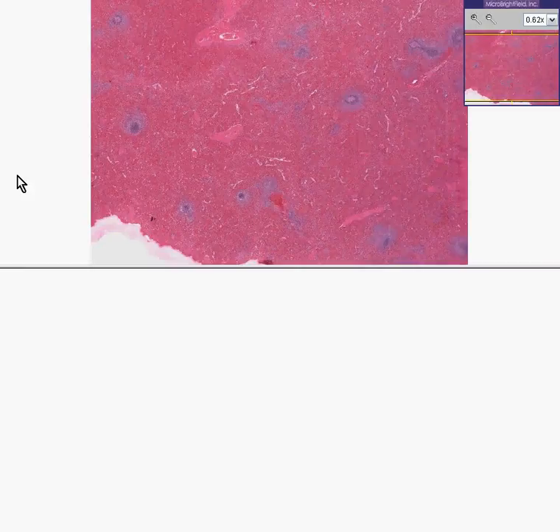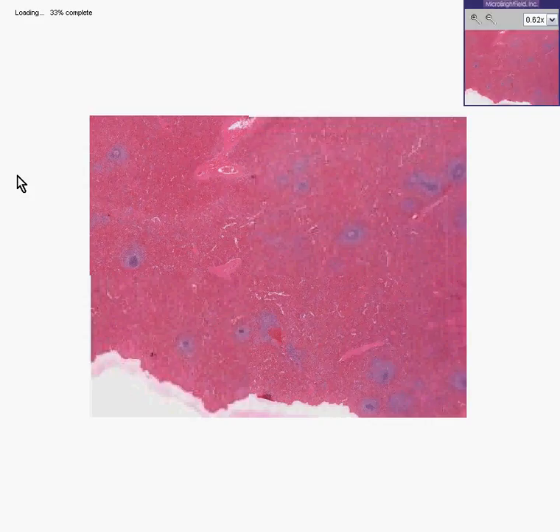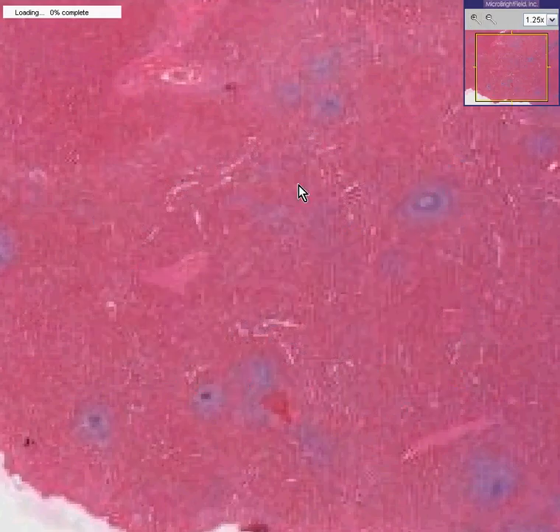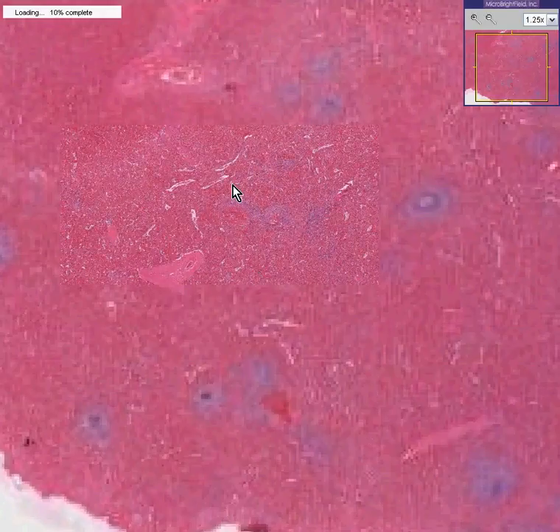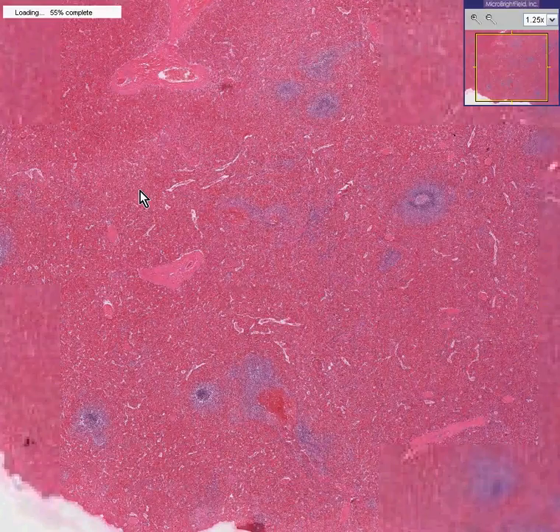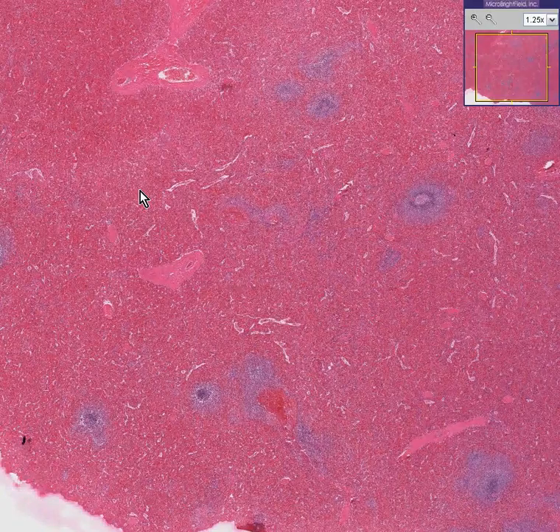Well, getting back to anemias, there are two types of anemias. There's the one type where the red cells don't live as long as they should, 120 days, and those are called hemolytic anemias. And then the other type is when the red cells aren't made as nicely and effectively as they should be. So in hemolytic anemias, where the cells are destroyed more quickly, that generates more activity in the red pulp of the spleen, because that's what the red pulp is supposed to do, destroy blood cells.